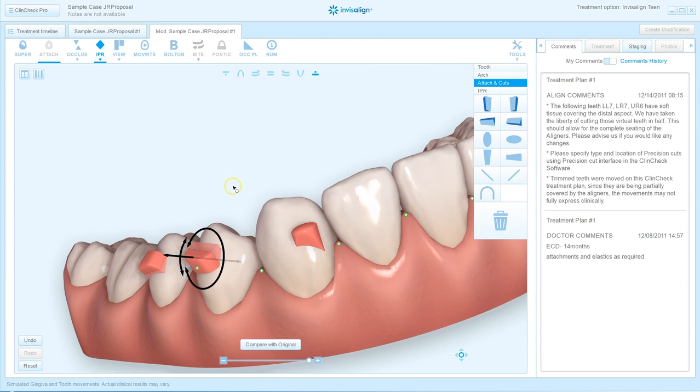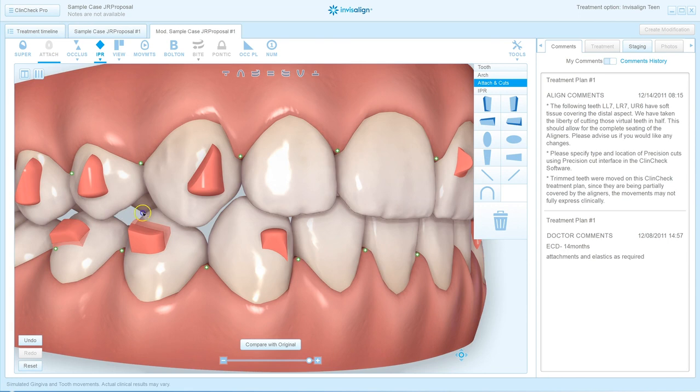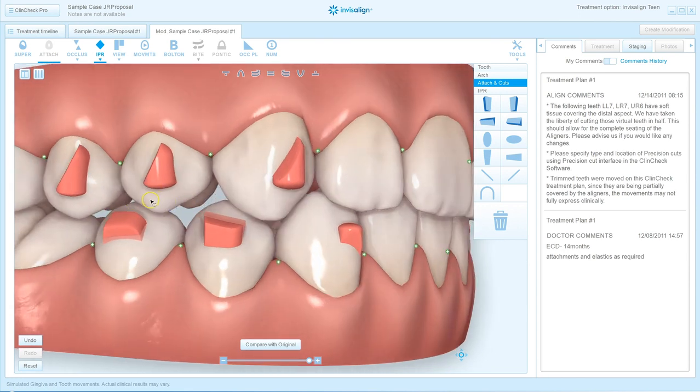There are still a number of changes I would have to make to this ClinCheck to make it successful, including increasing the curve of Spee leveling by erupting the premolars more, so that at the end of the ClinCheck we don't have an open bite but might even have hard contacts in these teeth. We need much more leveling of the curve of Spee, more intrusion of the lower incisors, and more torque of the upper incisors. There are a few changes we're going to make to this ClinCheck.